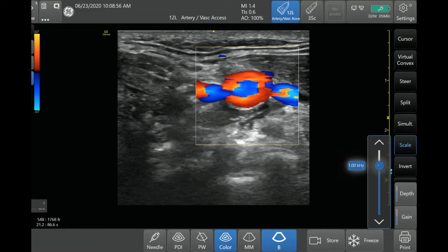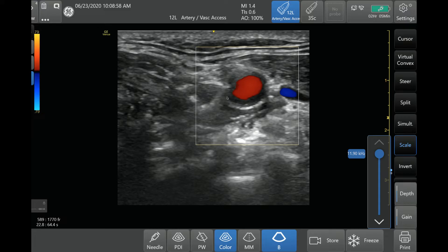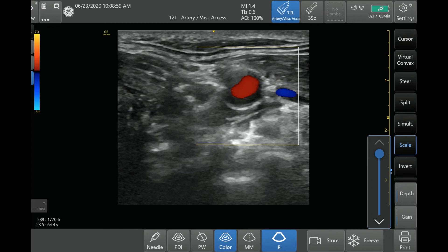Now I'm going to increase the scale all the way to the highest level. You can see now it's detecting 79 centimeters per second, which is going to be too high for our settings, and you're not going to be able to see as much flow as you would want to. Here's the carotid artery — you can see there's obviously flow around the outside or adjacent to the artery wall, but you don't see it. It looks dark right there because you're not detecting those lower flows.